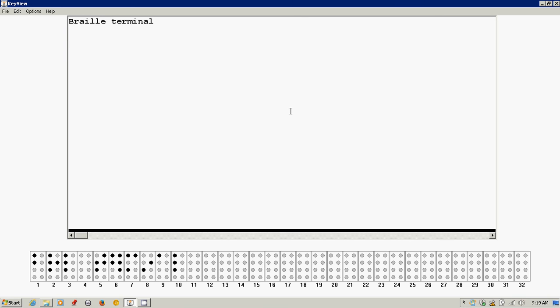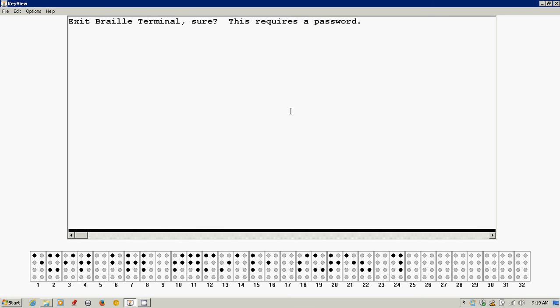Now, at any point, if the student tries to go to the main menu, I'll press Space with all six dots. Exit braille terminal, sure. This requires a password. It says exit braille terminal, are you sure? This requires a password.